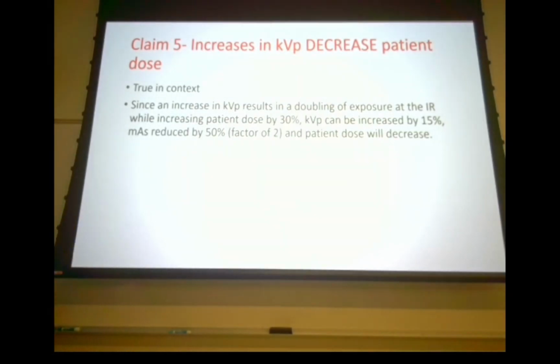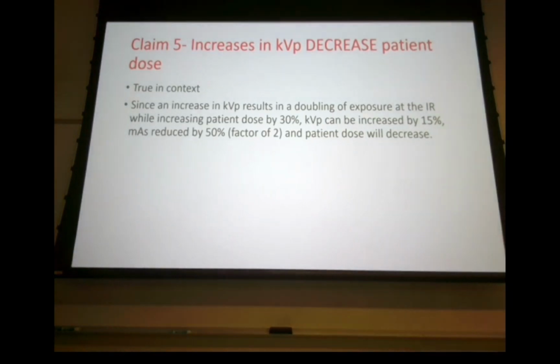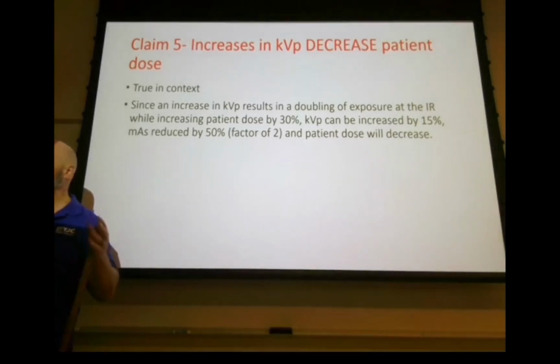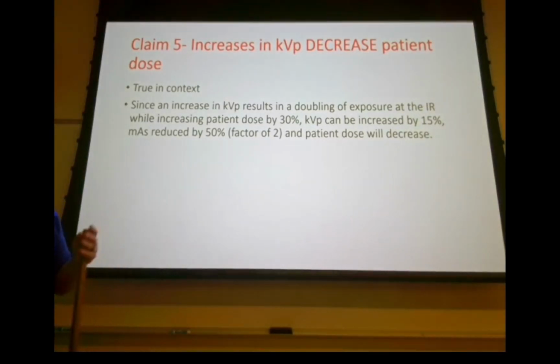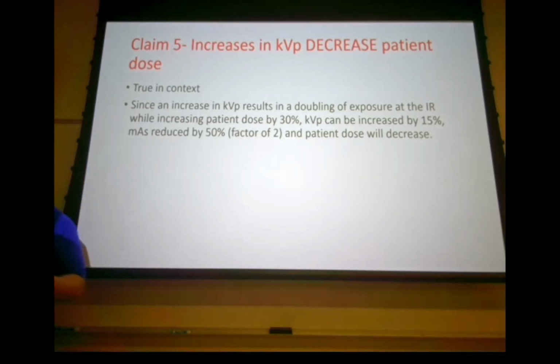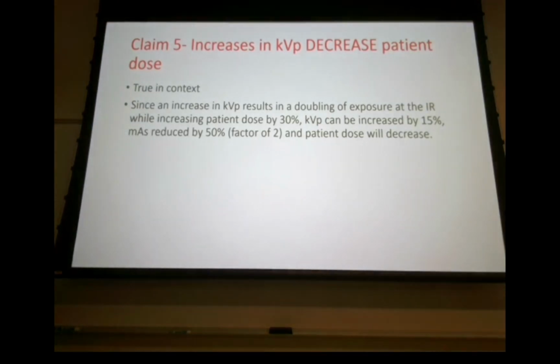Okay, so now you got to go back in, you made one exposure on the patient. Again, it's a pediatric patient. What do pediatric patients do? Squirm, they move all over the place, right? So you got to go back in, you got to make a second exposure. And you don't want to double dose the patient. Let's say your technique was perfect. Your index number showed that you were right where you needed to be. But you got to repeat because of motion. But you don't want to give the patient a full another dose.